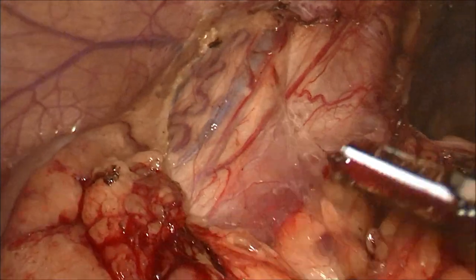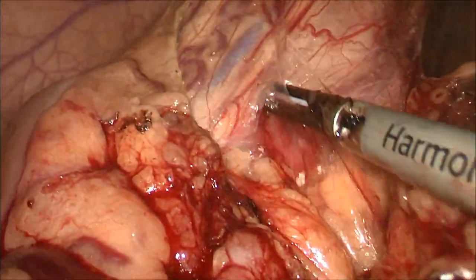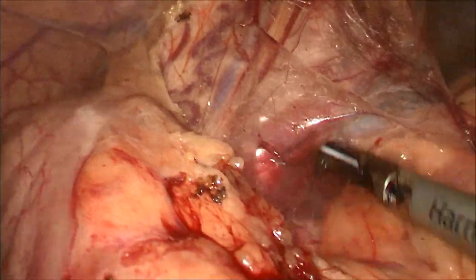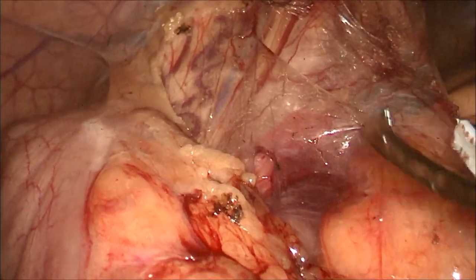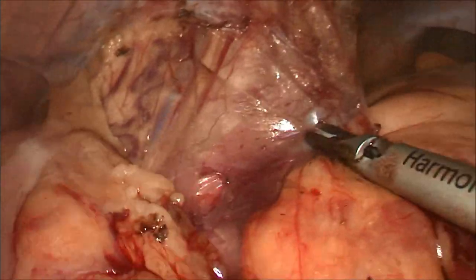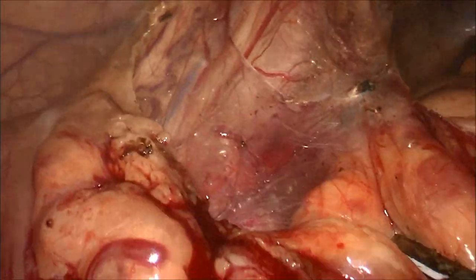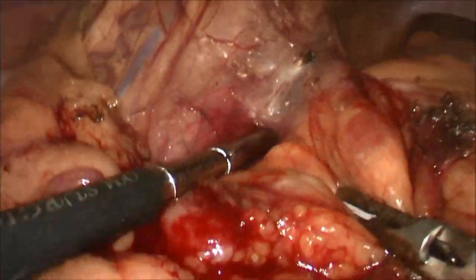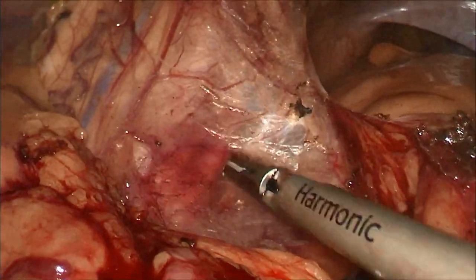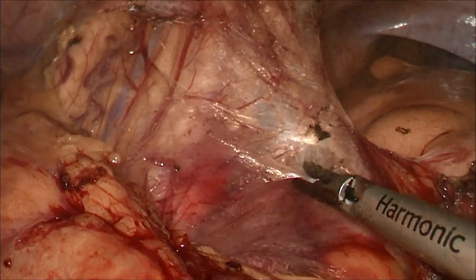Once the sigmoid colon is completely freed from its lateral attachments, you can appreciate the gonadal vessels, the iliac vessels, the iliopsoas muscle and the left ureter covered by a layer of retroperitoneal fascia.